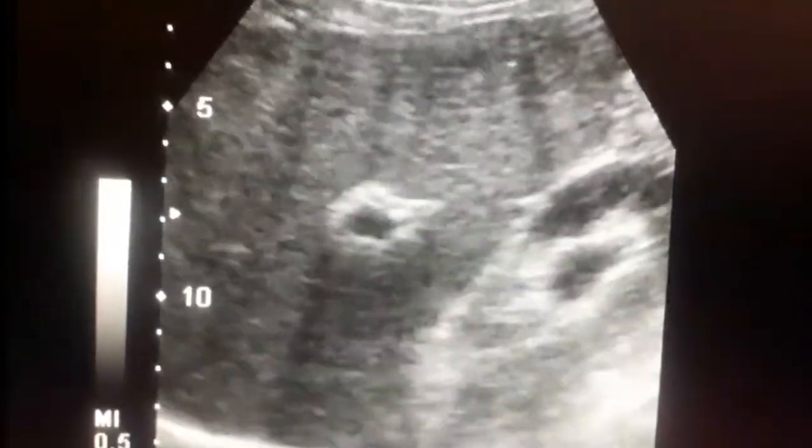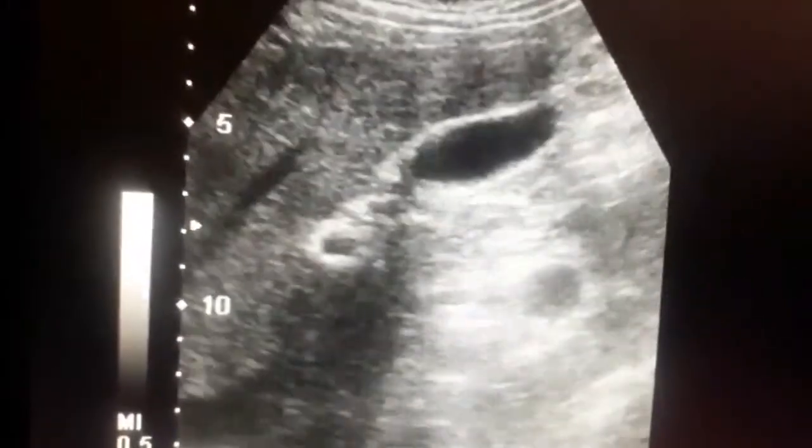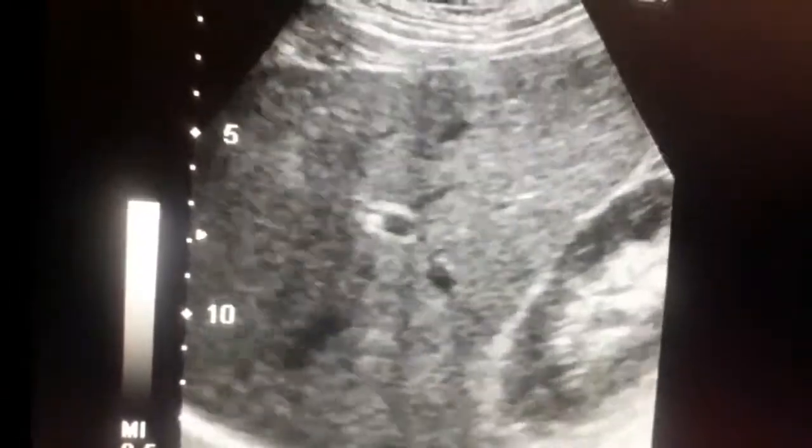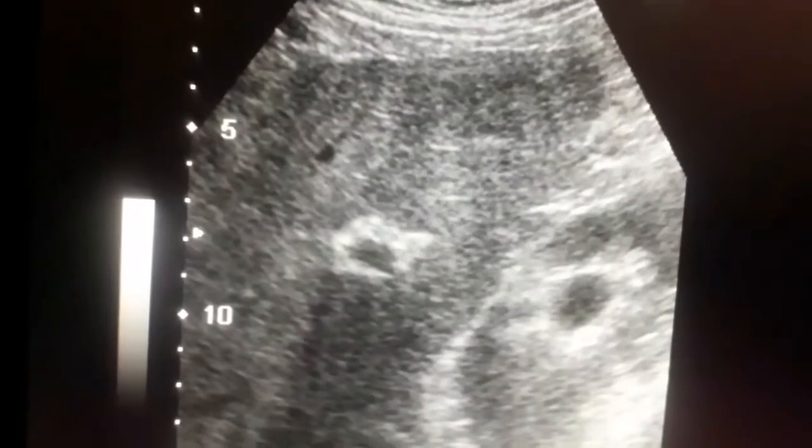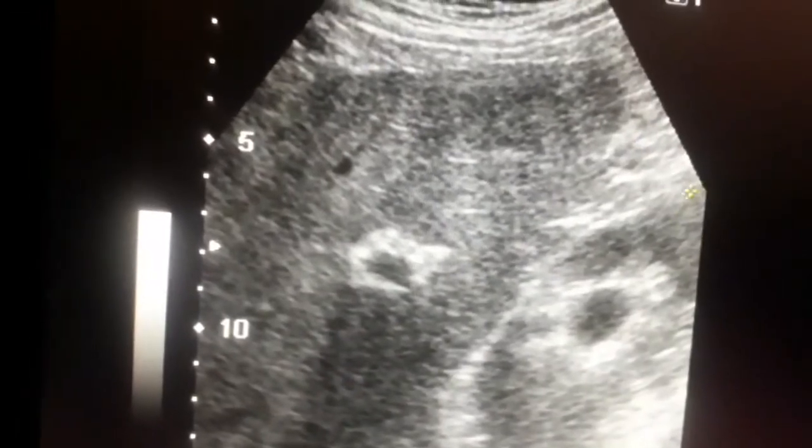In this ultrasound we will also show you how to measure the portal vein and the bile duct, which are usually present side by side. You can also see the kidney that is having a distended pelvis.